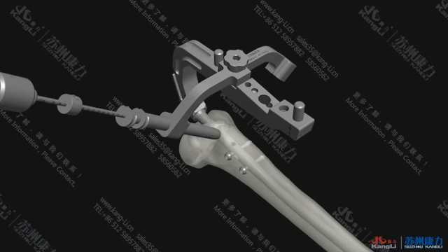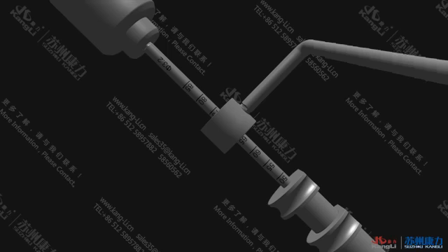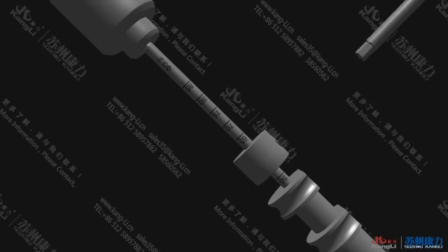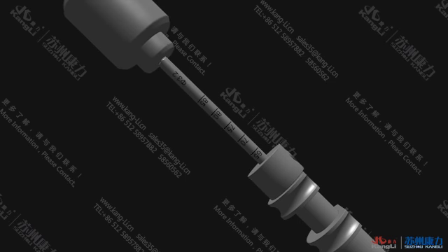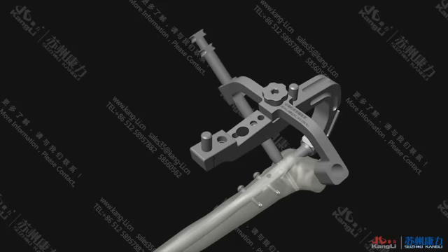When the phi 3.2 drill bit has drilled through the first layer of the bone cortex and reaches the inner wall of the contralateral bone cortex, adjust the distance between the ball spike on the phi 3.2 drill bit and the inner sleeve to about 0.5 cm, using an SL wrench to protect the soft tissue of the contralateral skin. Then continue drilling until the contralateral bone cortex is drilled through. Remove the phi 3.2 drill bit and the inner sleeve.